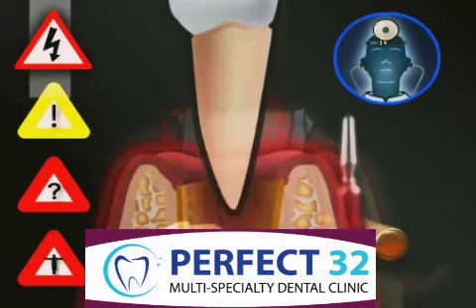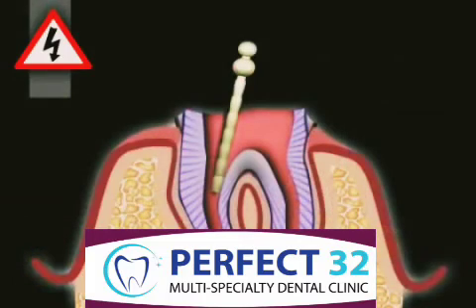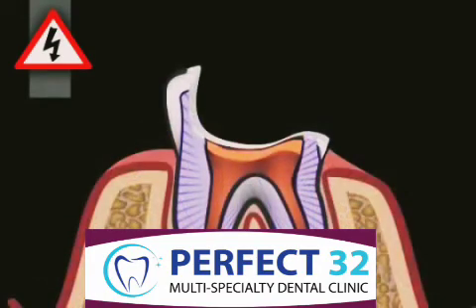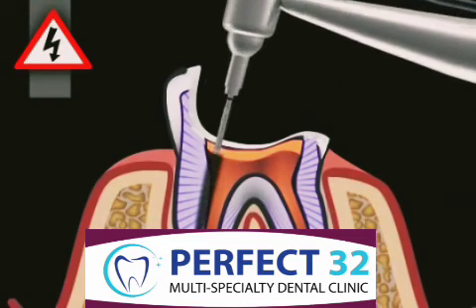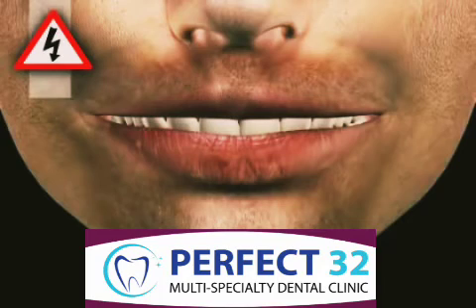At this point, we will only discuss the specific complications encountered with core buildup. These are, for example, post-tooth fracture. You can find out more in the video by the same title. Root perforation during excavation. You can find out more in the video with the same name. Luckily for patients, such complications have become very rare due to positive developments in medicine in the last few decades.